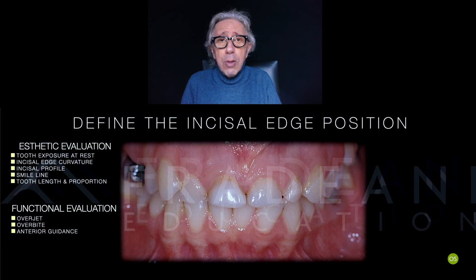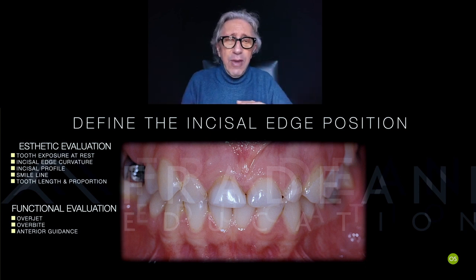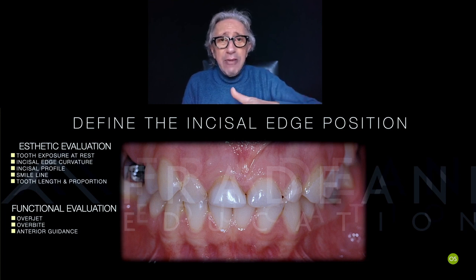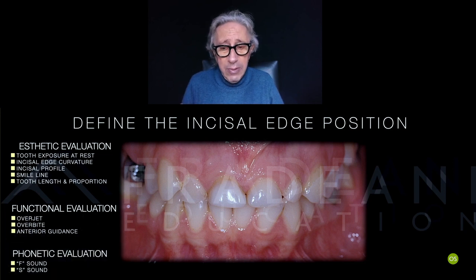And then, of course, you can decide your overjet or overbite value according to the clinical test. That's very important. So the numbers are okay, generally speaking, 2-3 millimeters, but then you have to test in the patient's mouth, always having the rule in your head that you have to avoid any contact in the posterior area during excursive movement, but still have the chance to move the mandible very easily with no muscle involvement. And then you have phonetic evaluation with S and F sounds.